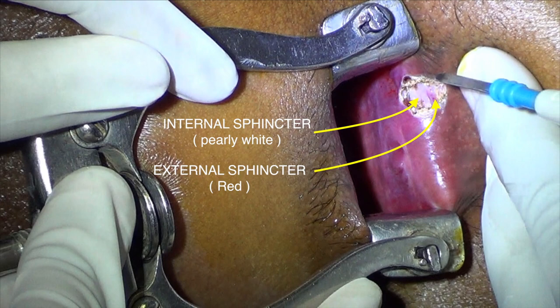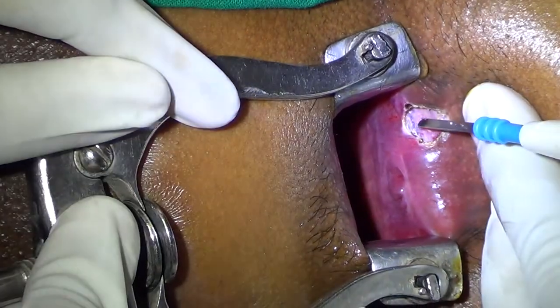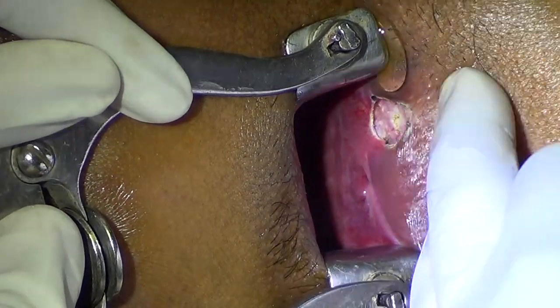The external sphincter will jump when you touch it with the diathermy. The internal sphincter will get retracted when you cut it. It's very difficult to cut the external sphincter because it will jump — the moment you touch it, it will jump. See, it jumps.